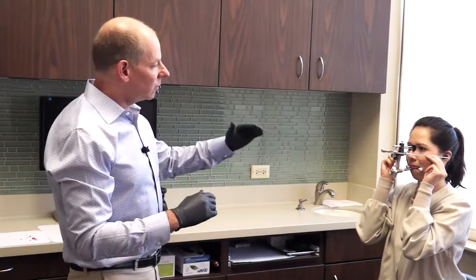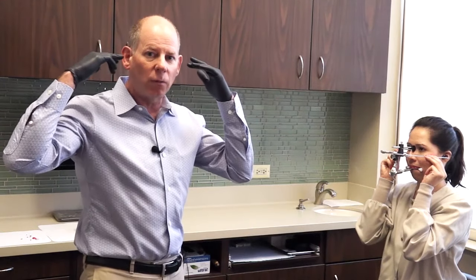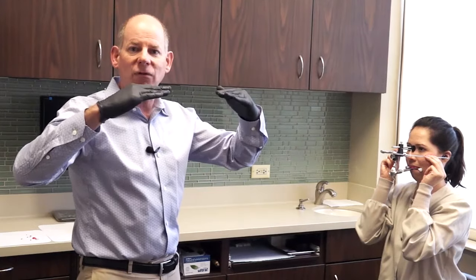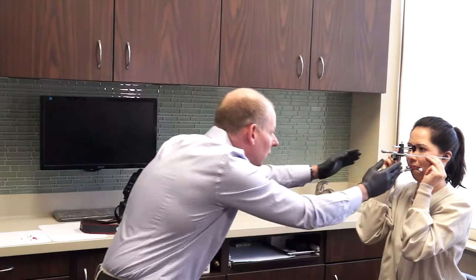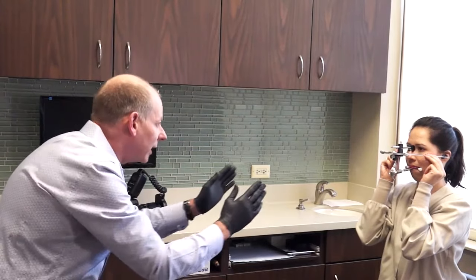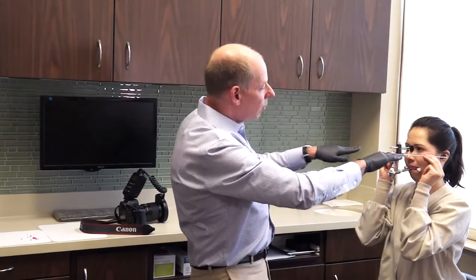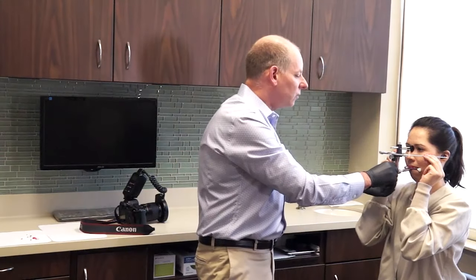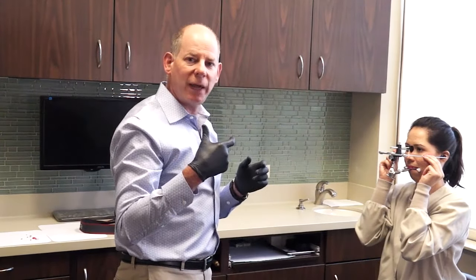With Erica moved to the assistant stool, it's much easier for me to evaluate whether the face bow is parallel to the horizon. It's not uncommon for one ear to be higher or lower than the other, so I often need to move the ear bow up on one side and lower on the other to get it level with the horizon. I step back, observe, and in this case her left side is a little lower, so I tilt it — you can use a small level or eyeball it. Once satisfied the ear bow is parallel to the horizon, I tighten the single screw mechanism connecting the bite plate to the ear bow.